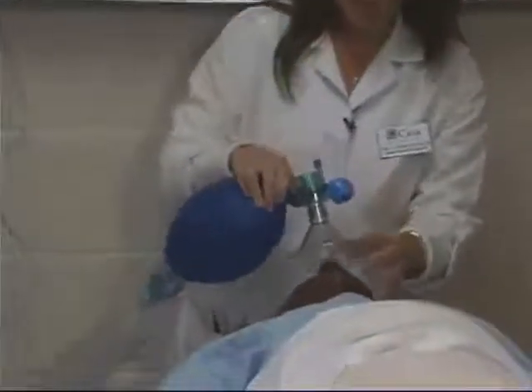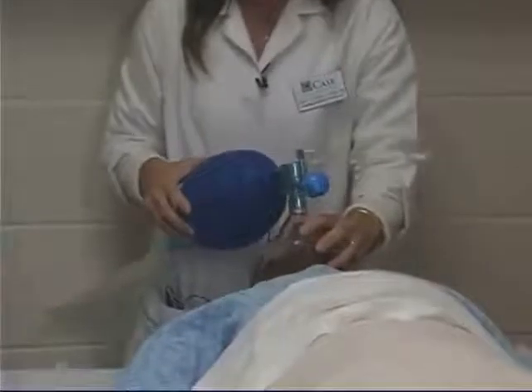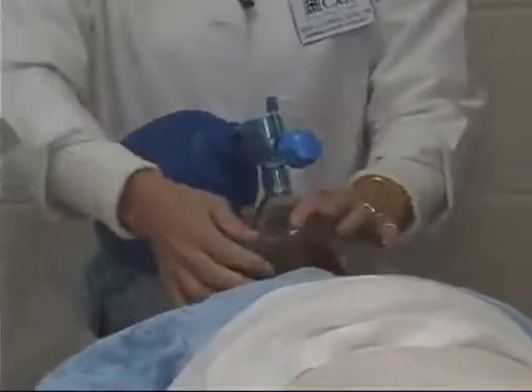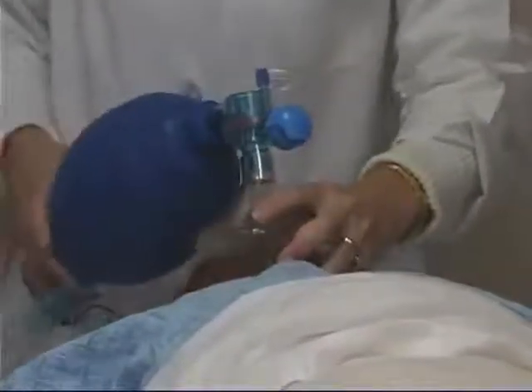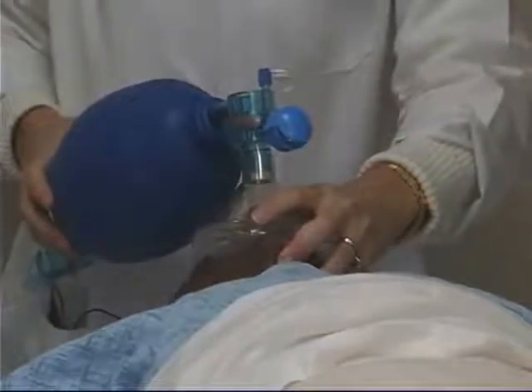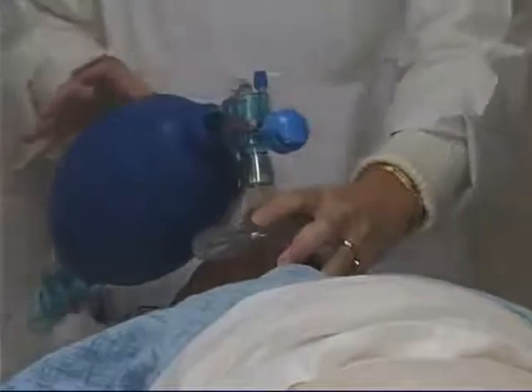When you apply the mask, you want to apply the apex of the mask over the patient's nose and the base of the mask at the patient's chin. You want to form a tight seal, keeping the jaw extended, and push on the mask to get a tight seal so that oxygen doesn't flow away from the mask.